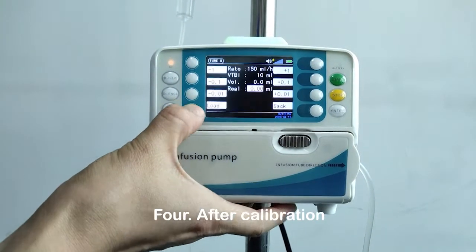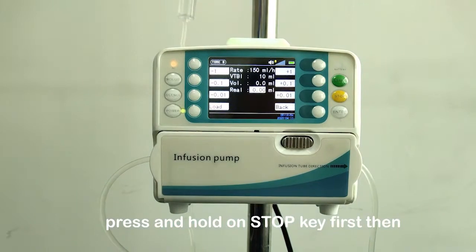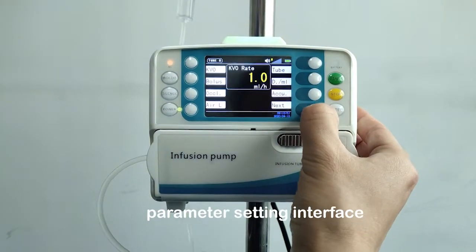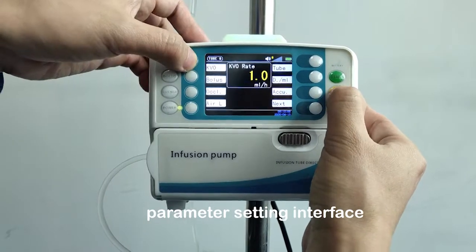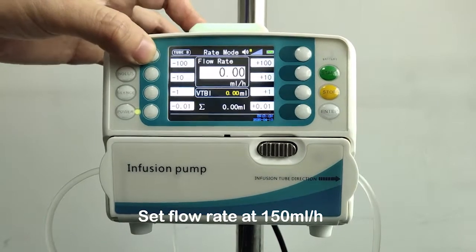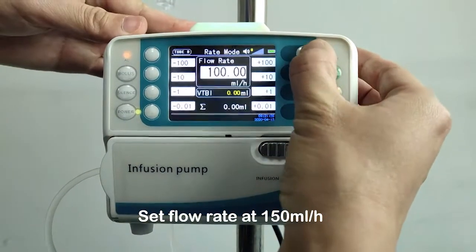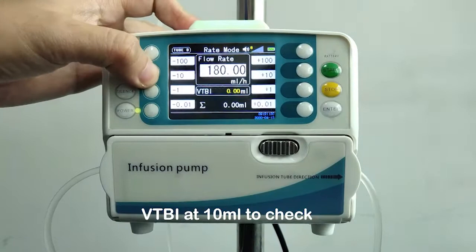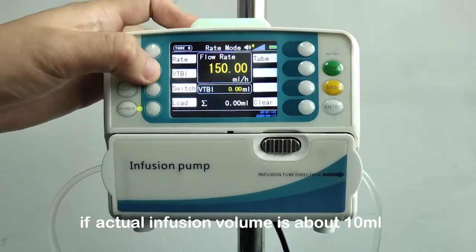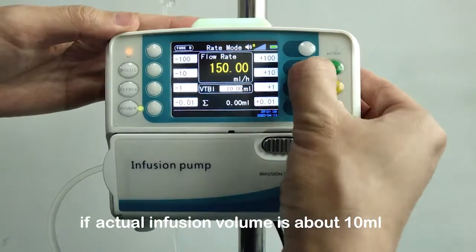Press the enter key to save the value and exit. The calibration of this brand of IV set is complete. After calibration, press and hold the stop key first, then press the first soft key on the top left to quit the parameter setting interface. Set the flow rate at 150 milliliters per hour and VTBI at 10 milliliters to check if the actual infusion volume is approximately 10 milliliters.